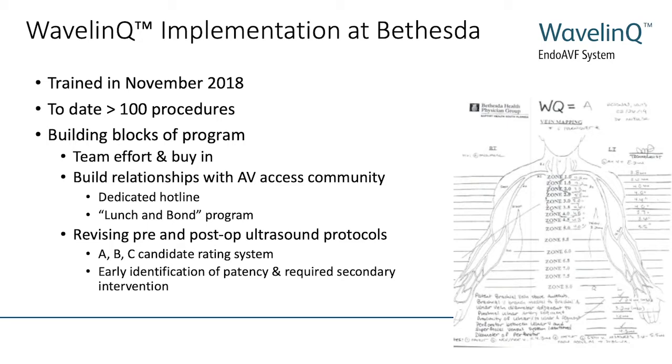So that patient is going to have a perforator that's 2 millimeters or greater. It's going to connect to either the ulnar or the radial vein, most of the time to the ulnar vein. That ulnar vein will be of reasonable diameter, usually about 3 millimeters. There will be proximity between the ulnar vein and the ulnar artery, less than 1 millimeter.